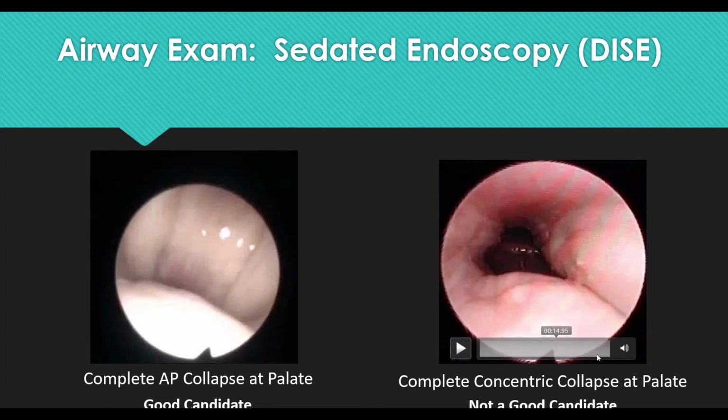And I'll tell them, look, insurance is paying for all this equipment for you. Do you think they're doing it because it doesn't work? Clearly you need this to treat your underlying comorbidities so you don't have further complications as time moves on. So patients will start with that, and then there are patients who are seeking other options early on, even before they have their first trial of CPAP.